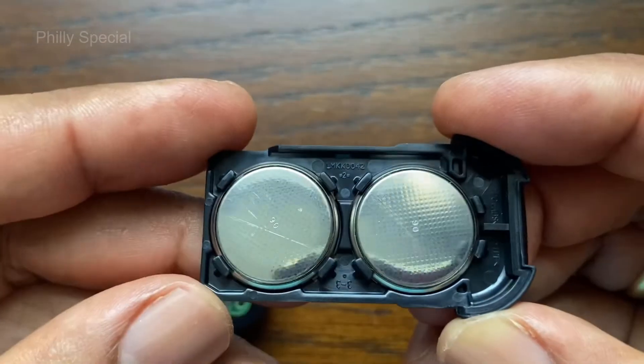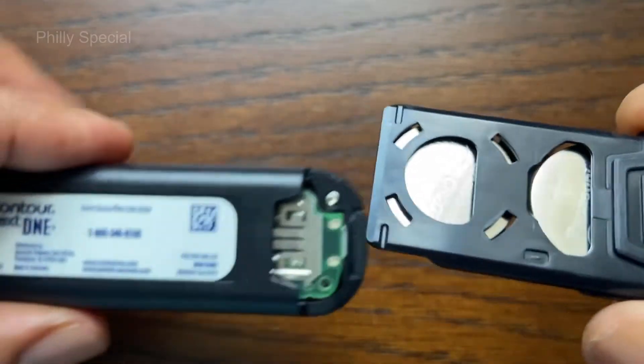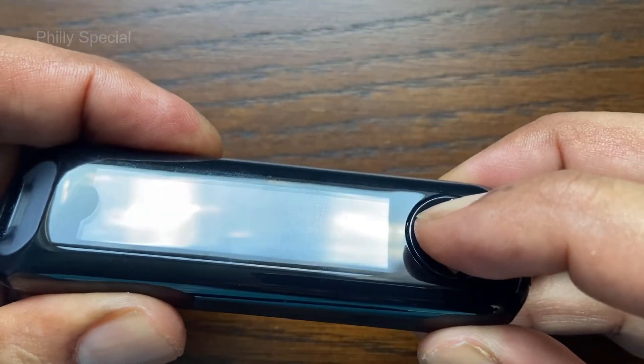If you put the new batteries in the meter within 5 minutes of taking the old batteries out, the meter saves all your settings and results. Slide the battery holder back into place. Next, turn on the meter to make sure it is working fine.